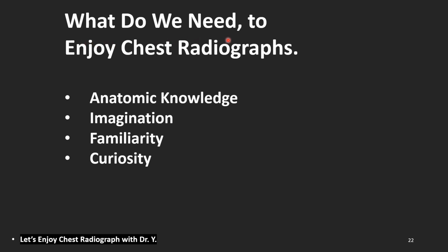What do we need to enjoy chest radiographs? As I said before, anatomic knowledge, imagination, and familiarity. I now want to add one more word: curiosity.